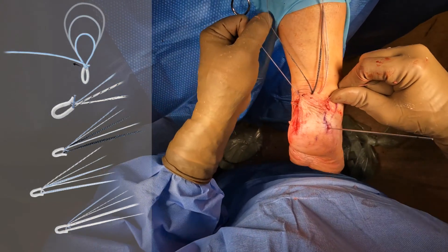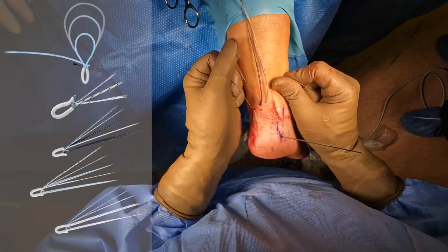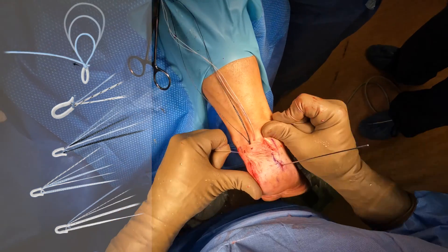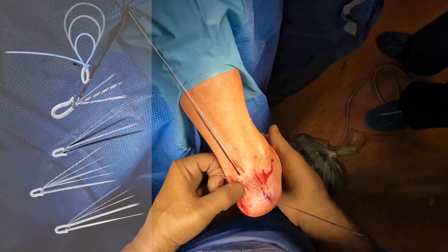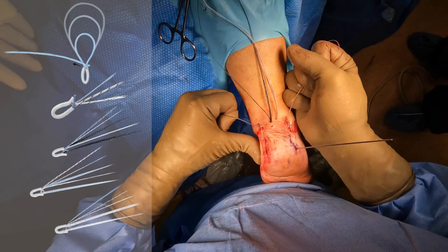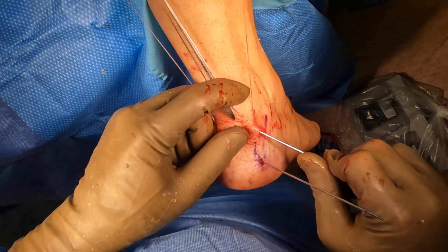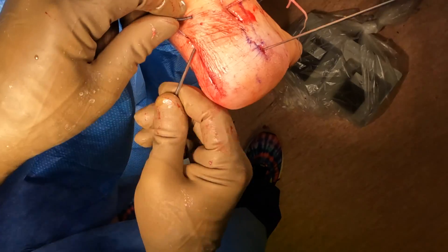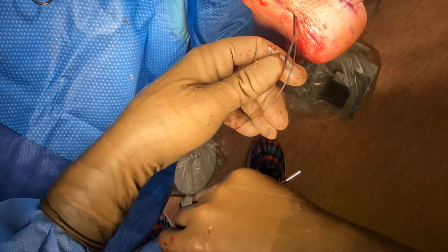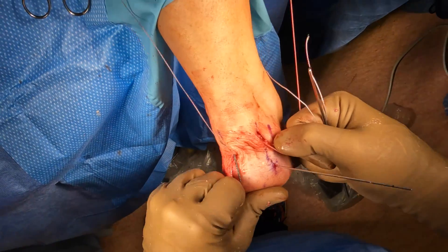I'm tensioning those — it's setting our loop that's within the cancellous bone of the calcaneus. And that is also a rip stop to prevent those superior fiber tapes, which you can see are still on the outside portion of the skin, from pulling inferior. Now that we have those nice and snug, the next step is to grab those fiber tapes. I've pulled our lateral ones lateral, and now I'm pulling the medial ones. These are on the exterior portion of the Achilles, but internal to the skin. I'm testing to make sure that we have a nice substance of these fiber tapes in the Achilles tendon.